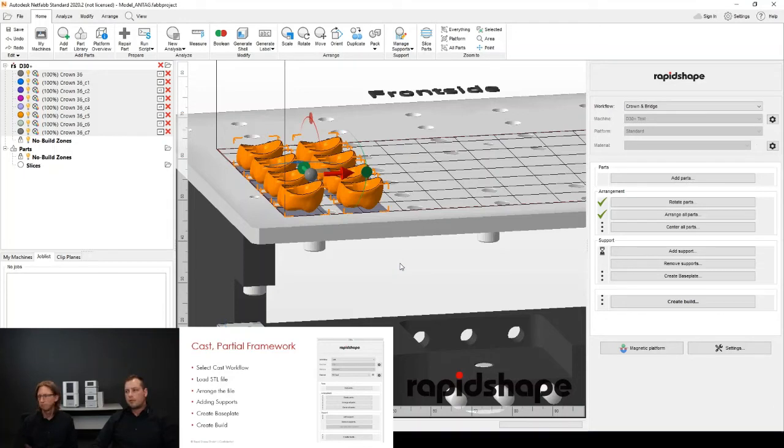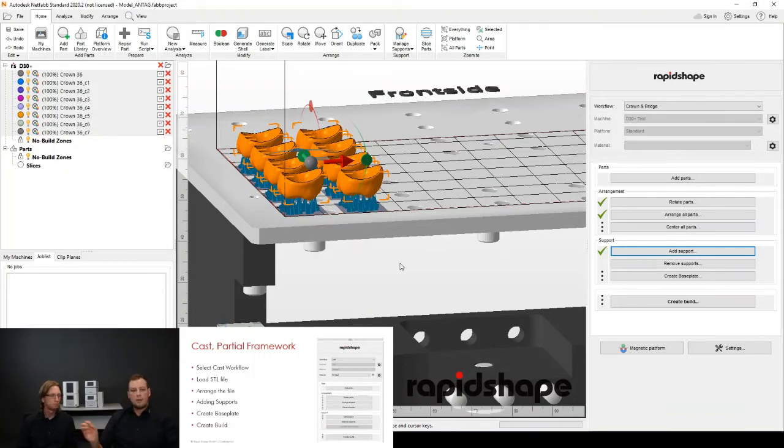So generally speaking, the supports that are created with the support scripts work reliably, and that's why they're available. It comes down to what version of NetFab you're running, and if the customer has the latest engine file installed, because it makes no sense for machine 1 to work correctly and machine 2 not, if they have exactly the same software. But like Robert said, this is something that we would encourage you to contact our service department about, so that we can go and investigate directly on the customer PC to try and resolve this.